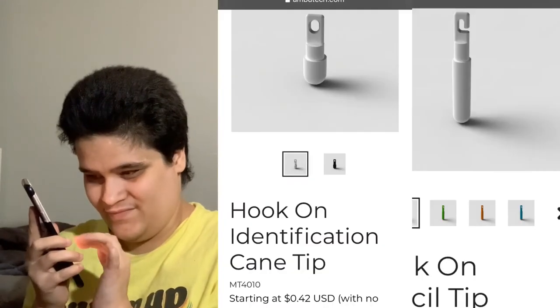What I like about Ambutech is they have tips in different colors. Not all of their tips come in different colors — sometimes it's just the top part, like a highlight. But for the pencil tip they actually have them in all different colors. When I was growing up the only colors I saw were white and red. I asked one person why they chose a red tip, and they said they just liked the color — liked that it was different, or they needed the contrast.